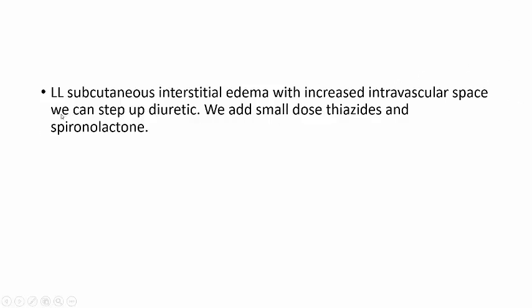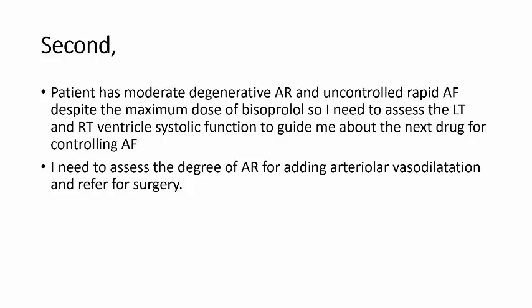We can step up diuretics because we have interstitial edema and increased right atrial pressure and increased left atrial pressure. We add a small dose of thiazide and spironolactone to furosemide. And you see here how great point of care ultrasound in clinic can help you. Clinically, the patient has hypertension, 170 systolic, and pitting lower limb edema. Clinically, and by point of care ultrasound in clinic, I know now there is increased right and left atrial pressure. That means I can very safely step up the diuretics.